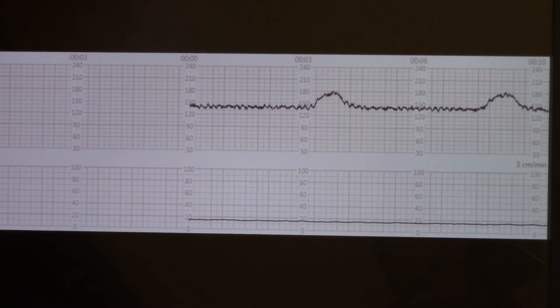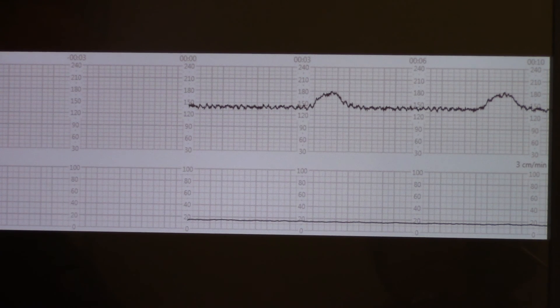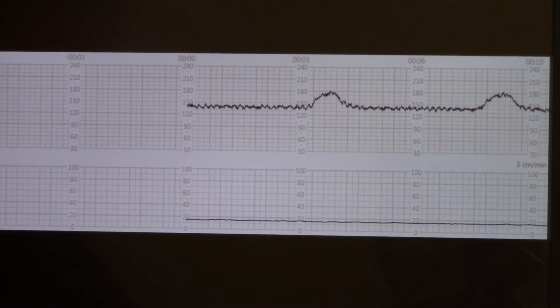That would be a reactive non-stress test, and it would be a sign of good fetal well-being. We know our placenta is doing great and our baby is able to get enough oxygen.